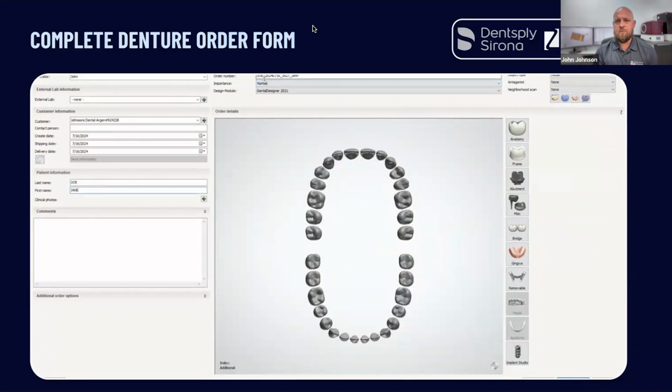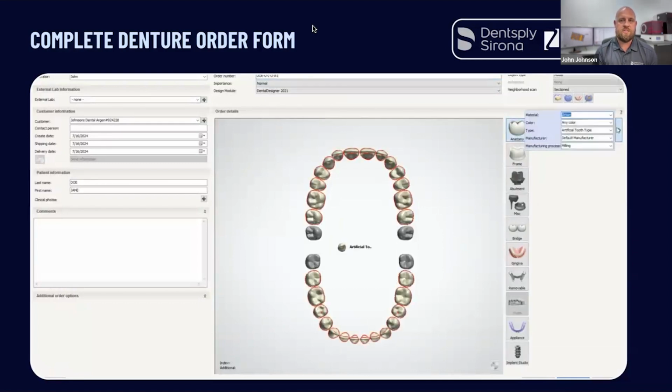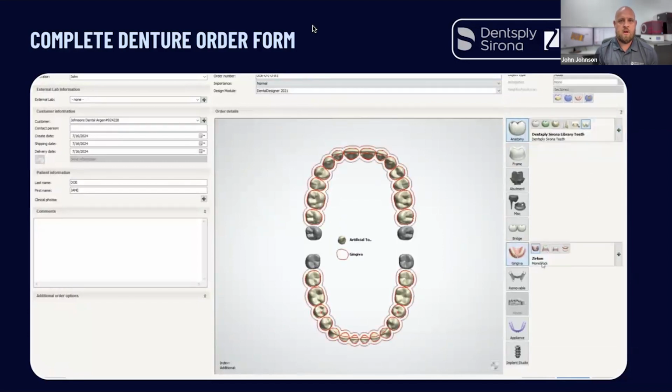But as you went through, there's also multiple options as to how you'd like to produce your denture teeth. Now, I prefer to produce my denture teeth in quadrants. So I would select posterior quadrants, anterior quadrants, and then I would bridge them. And that just tells the software to give me that step later on so that I can make these connections.